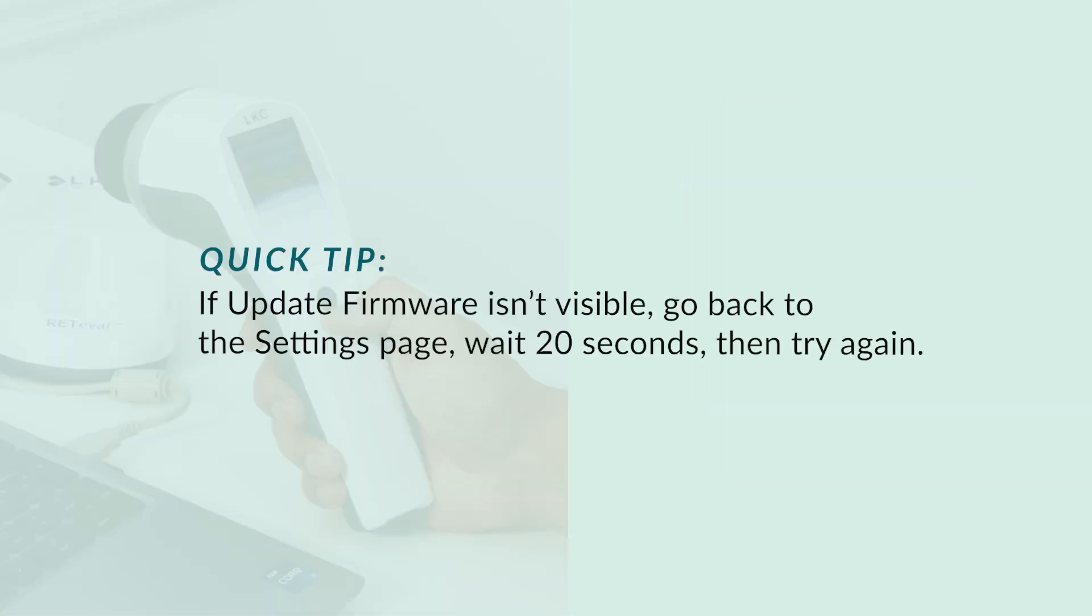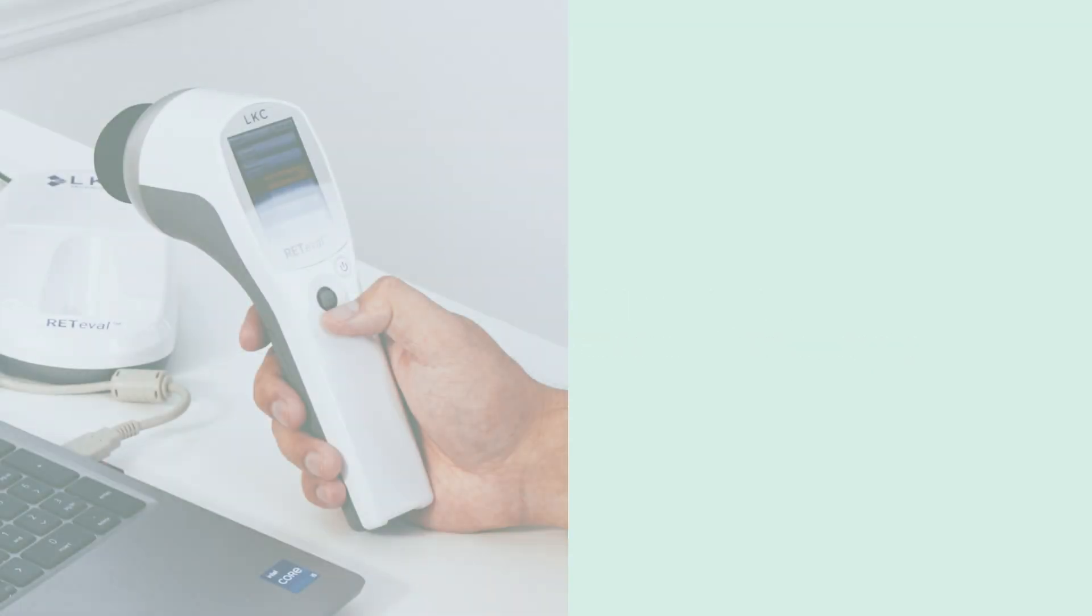Quick tip, if update firmware isn't visible, go back to the settings page, wait 20 seconds, then try again. The device performs self checks when removed from the docking station and the update firmware button isn't visible until those self checks are complete.